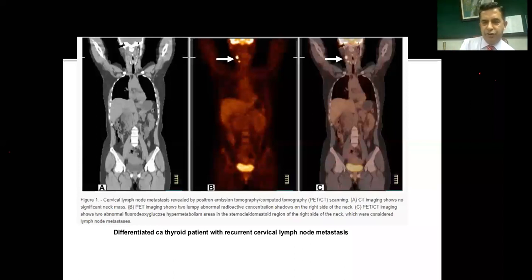But this is a PET radiotracer image, and here you can see the FDG PET localizing in the thyroid. Now, when we do the PET imaging and when we do the radioiodine imaging, the more de-differentiated the thyroid cancer becomes, the less it concentrates iodine. As long as the patient's cancer is differentiated, it will keep on concentrating the radioactive iodine, so it will be easily imaged using radioactive iodine. But as the tumor becomes de-differentiated or undifferentiated, it will stop concentrating the desired amount of iodine, so it will not be visualized on the nuclear medicine scan. So then we have to go to other imaging modalities.